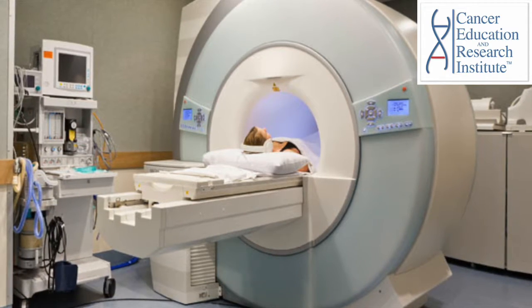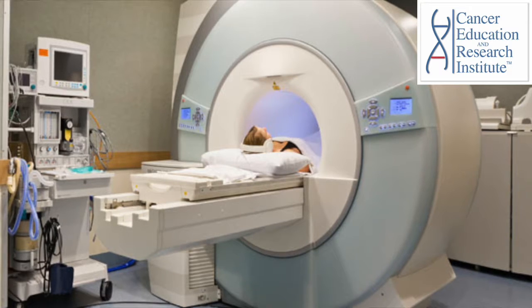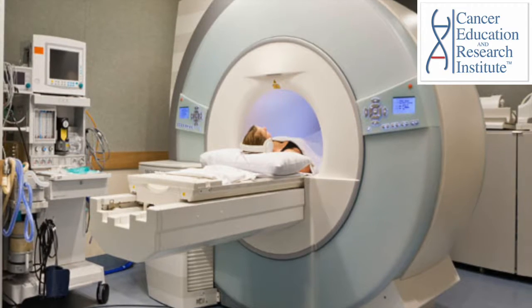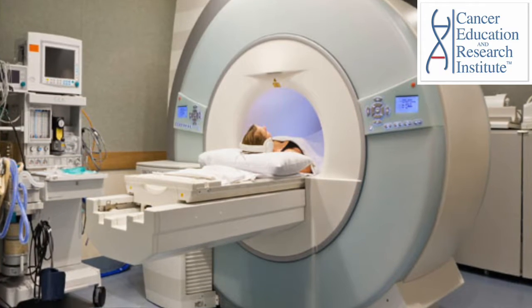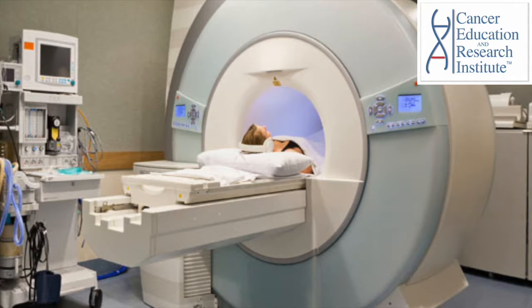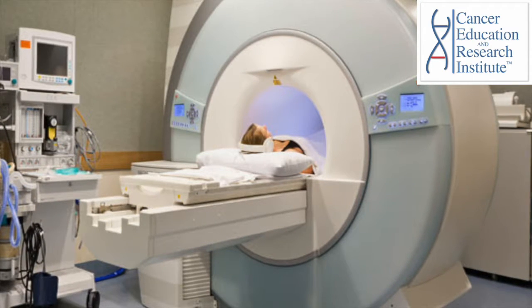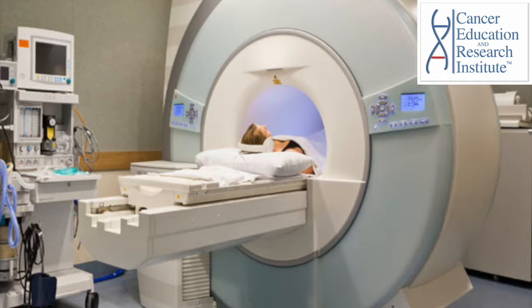During the scanning, the person should be immobile. Since the MRI device creates a repetitive noise, MRI could be noisy and uncomfortable for people who have claustrophobia, also because of the device's surrounding shape.